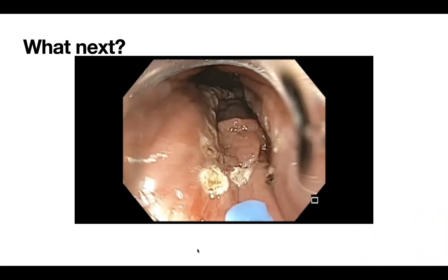For that reason, I used the adult colonoscope. You could also use an adult EGD scope, which also has a near focus function. But I feel more comfortable with an adult colonoscope, even for rectal lesions. That's just a preference.